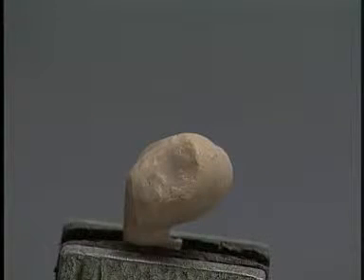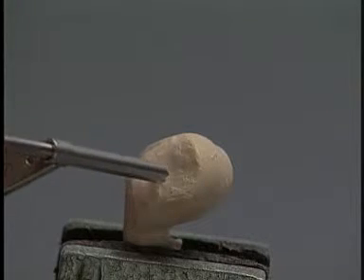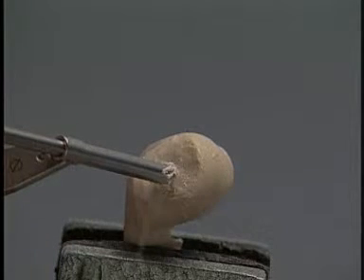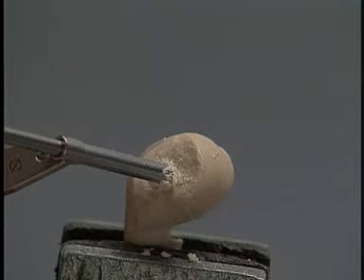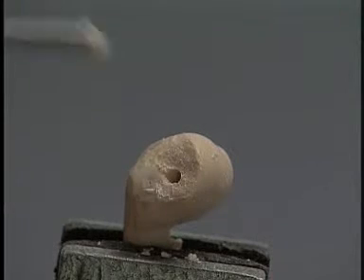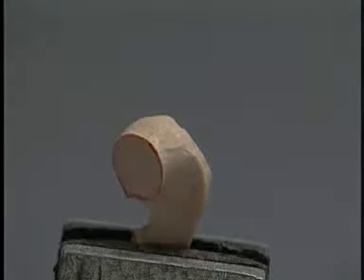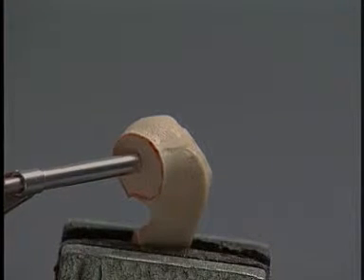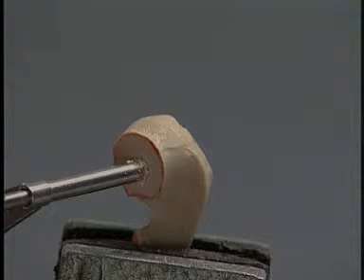The lag screw may be placed from medial to lateral or, as shown, from lateral to medial. The glide hole, which parallels the joint surface, may be drilled from a point just distal and cranial to the lateral epicondyle toward the fracture surface. Alternatively, the glide hole may be started at the fracture surface. This can be done in either the medial or the lateral fragment.